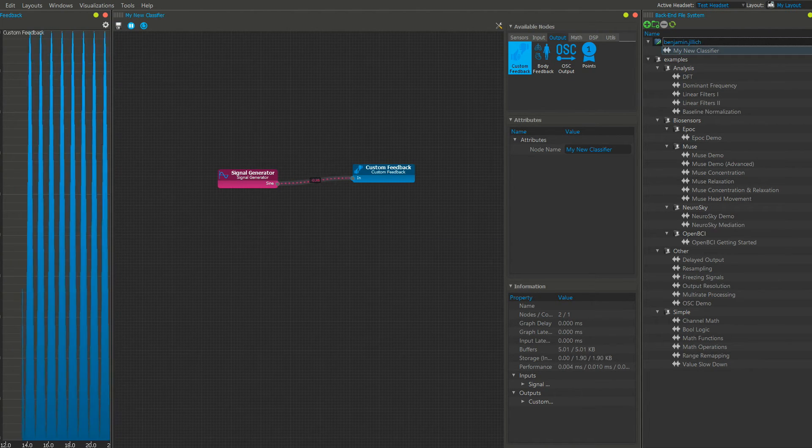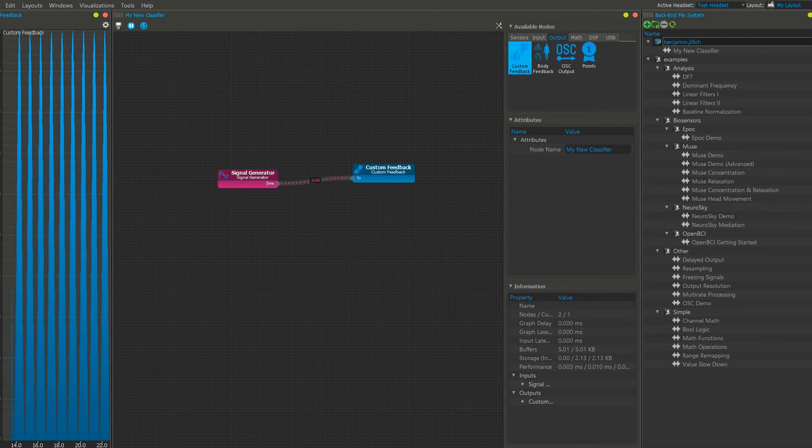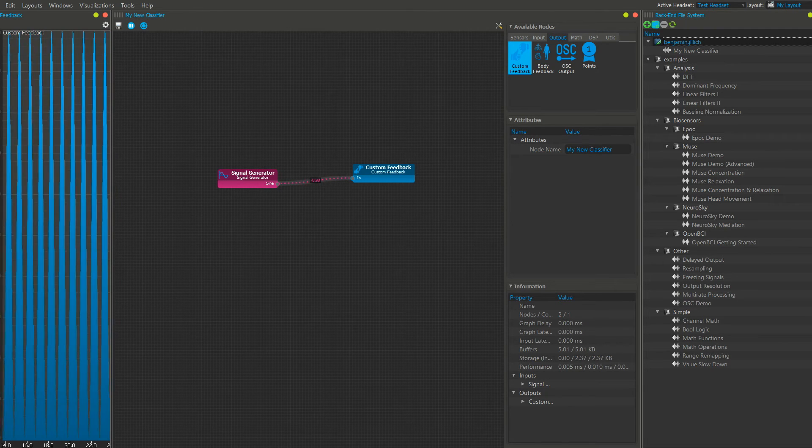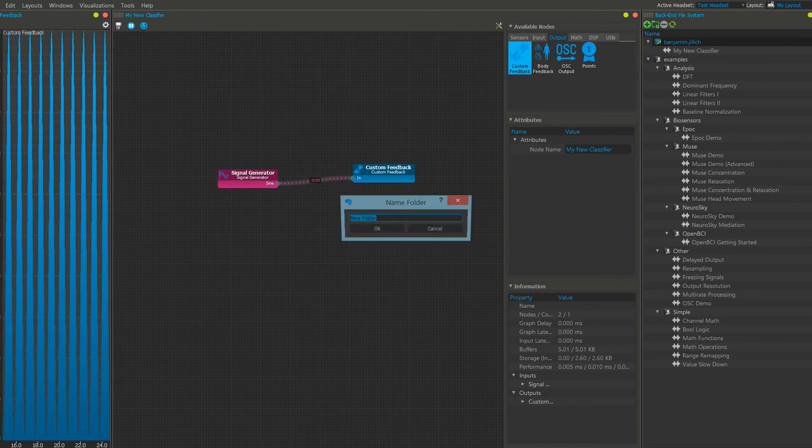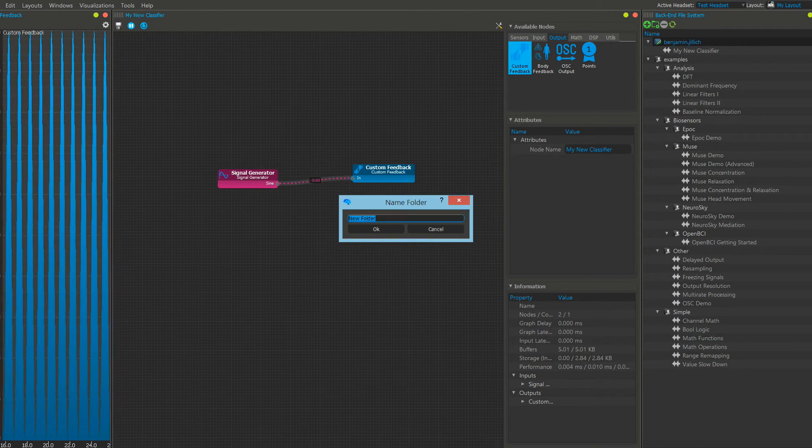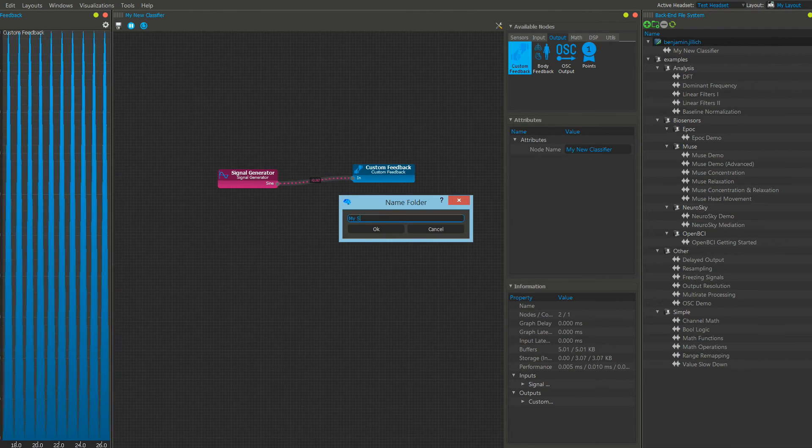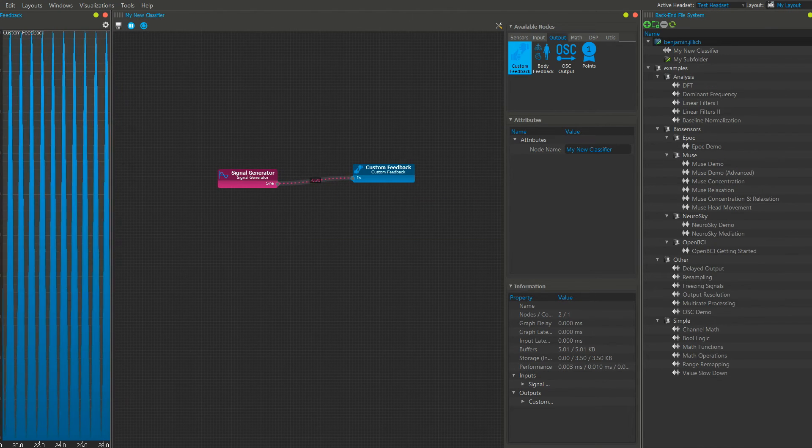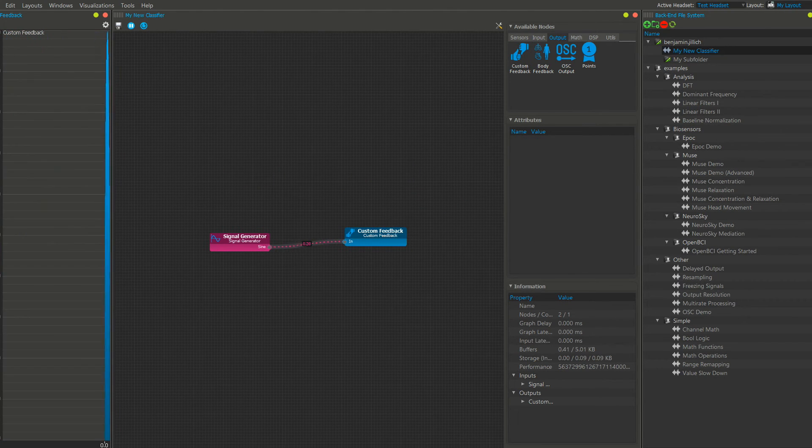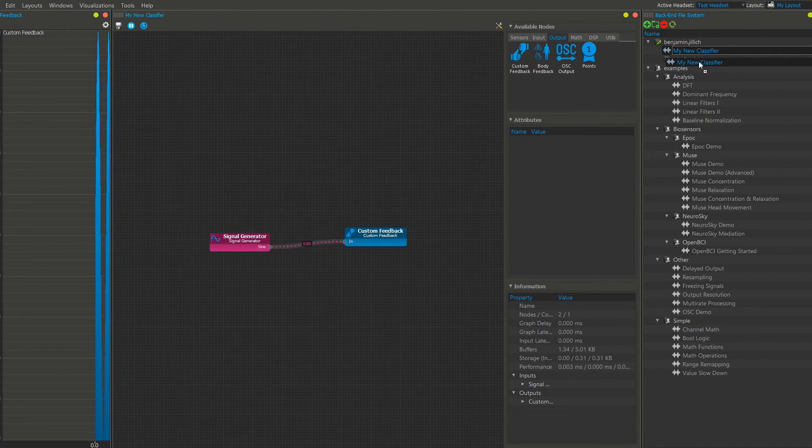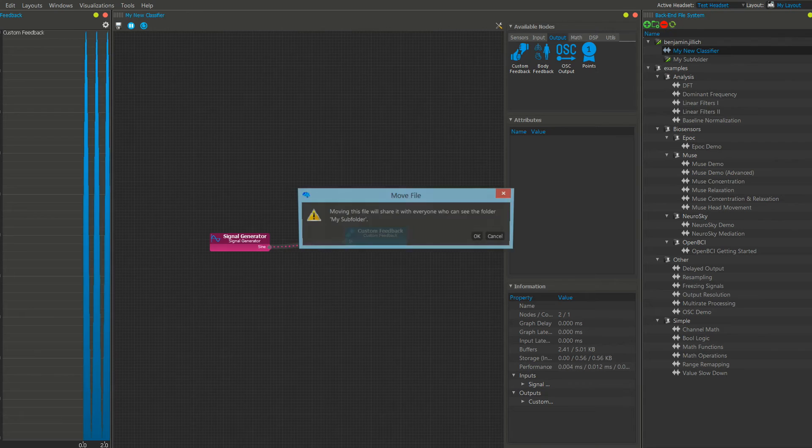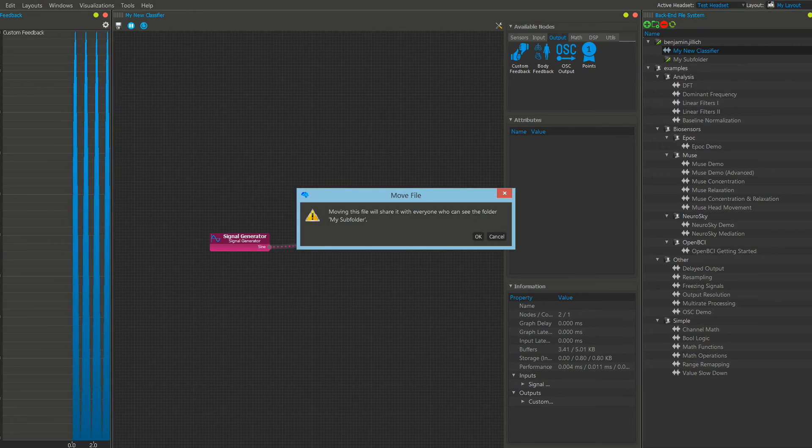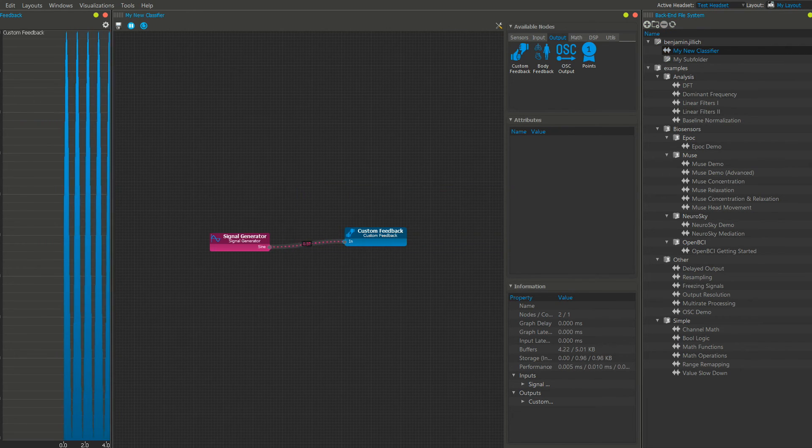Subfolders can be created with the icon next to the plus icon. And by drag and drop in your classifier, you can move them to different folders.